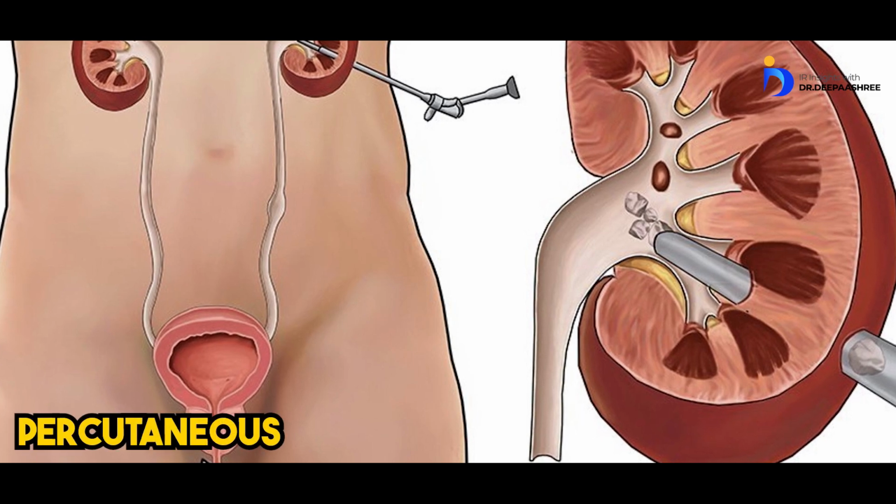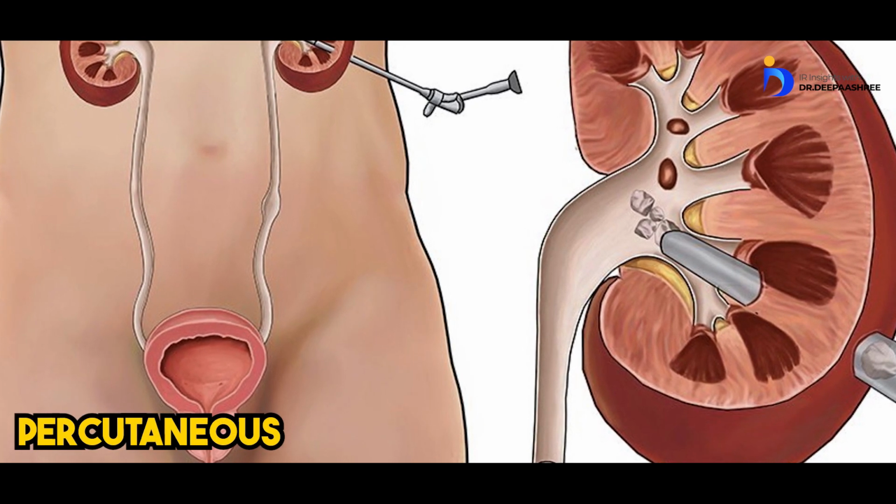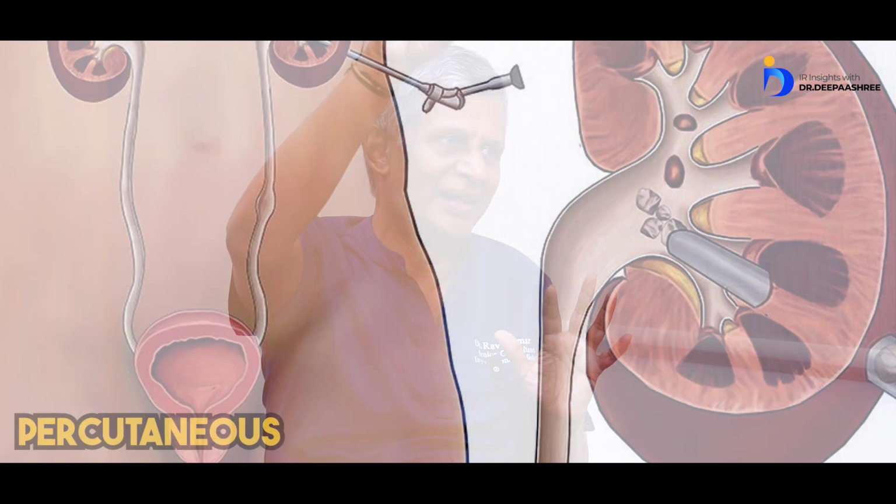And you use gel foam there, once you deploy the plug, from the microcatheter? Now I started using glue again. Glue, okay. Because once I'm sure that I'm in a good gastric varix, I modified my technique a little bit so that I percutaneously access the gastric varix through the splenic vein. And I know where my gastric fundic varix is.